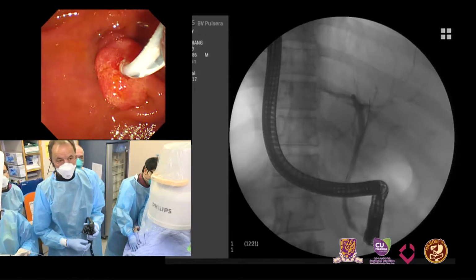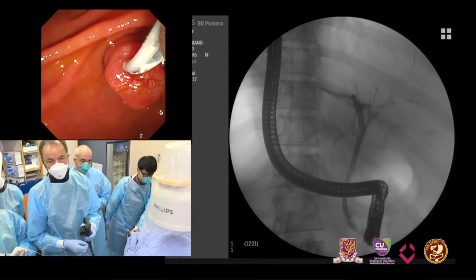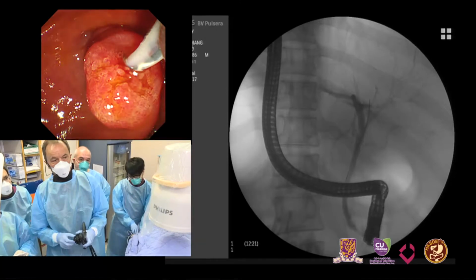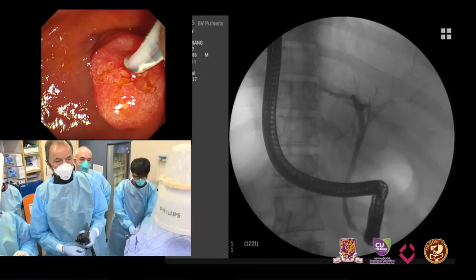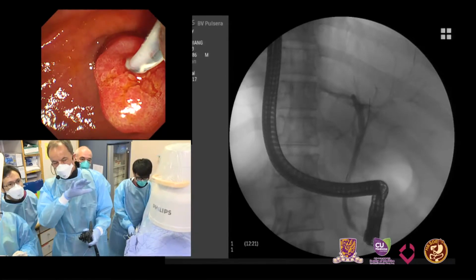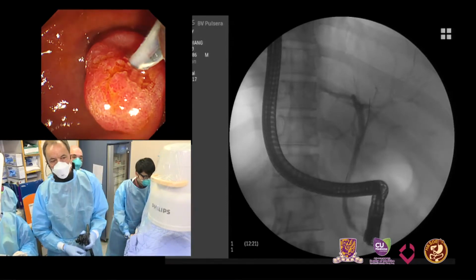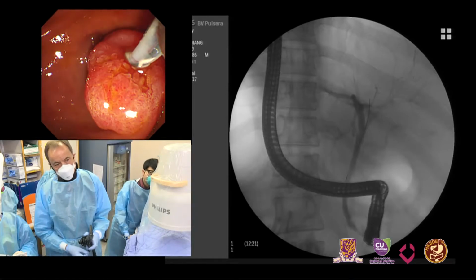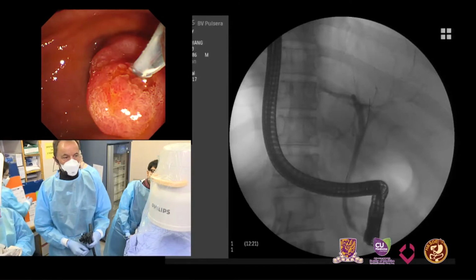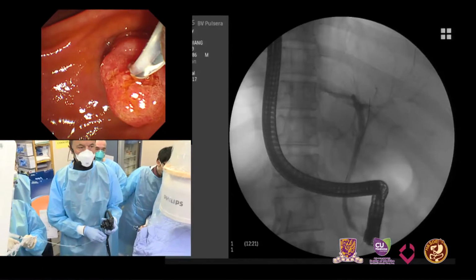But it's difficult to know if this is enough just to leave him without a stent. There's a concern that he needs longer treatment, so that's why we want to have some secure period. Yeah, I agree. And the narrow part was probably at the mid part of the CBD, crossing the scope. So that means then we would need a 6 centimeter long stent, 10 millimeter in diameter.